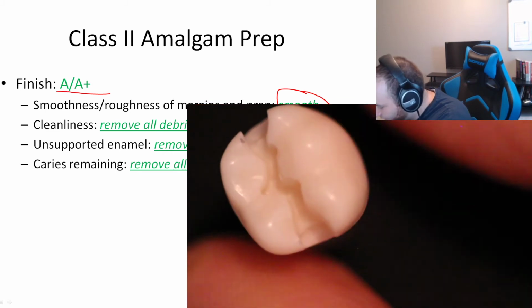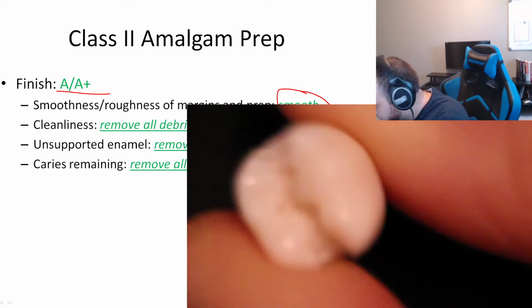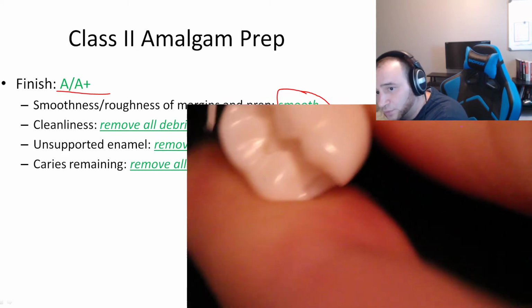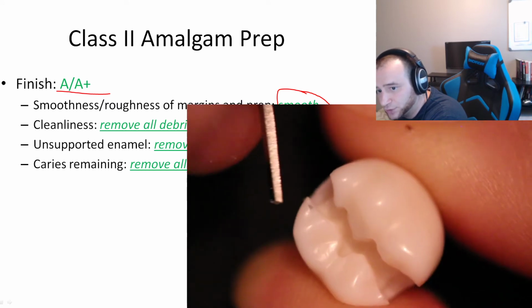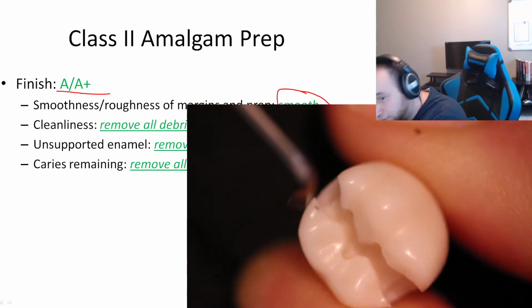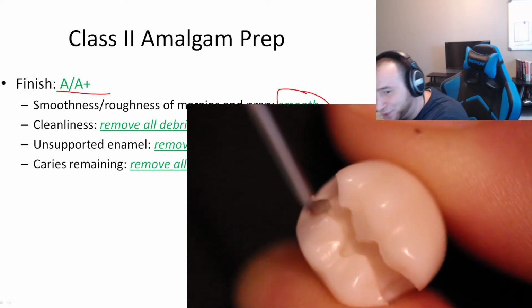So I could probably remove this with a hatchet. You can see here, I could maybe carve it out. If I could probably do this and just carve it out, right? Oh, you can't see. Let me make sure you're seeing there. Okay. So I could maybe carve it out or even go like this. If I take the 1 millimeter. Anyway, you don't want to do this, okay?